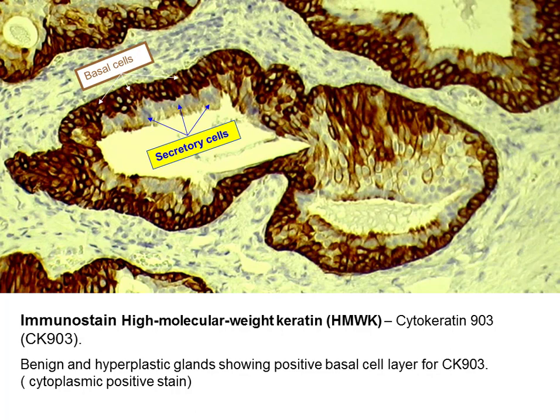Here you can see the benign hyperplastic reaction in the prostatic glands. In prostate cancer, if we have no basal cells, we talk about prostate carcinoma.